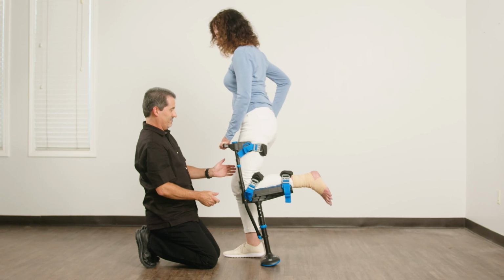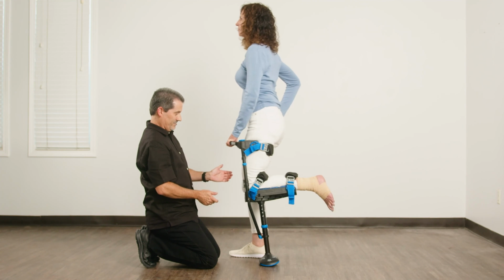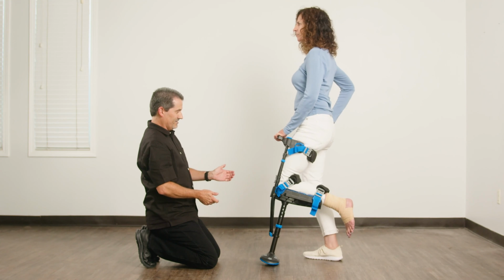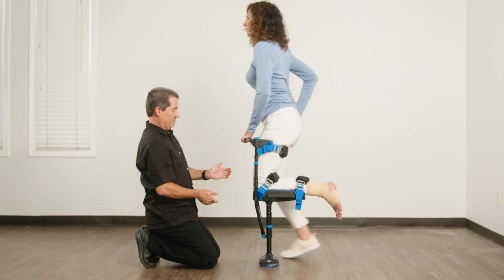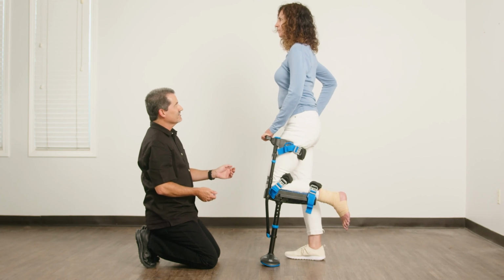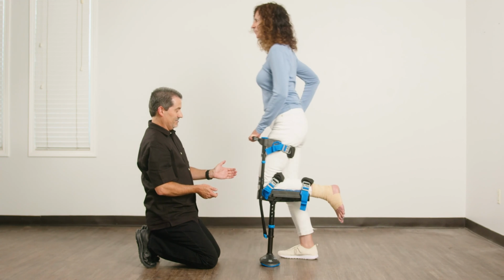Next, have the patient step back a little further with their good foot so that their good foot is behind the iWALK foot, as it would be in normal walking. As before, have them lean forward and take a step with their good leg. Then return the good leg back to being positioned behind the iWALK leg. Repeat the exercise until the patient is proficient.